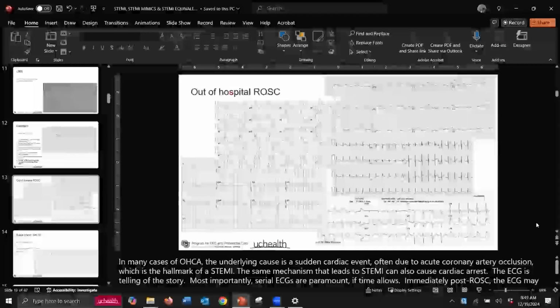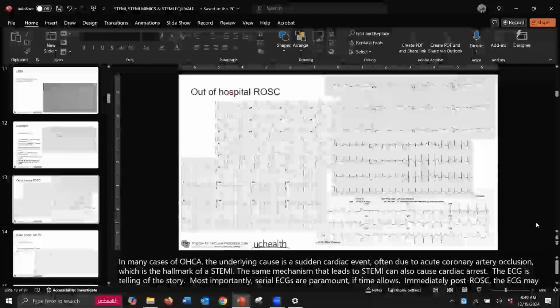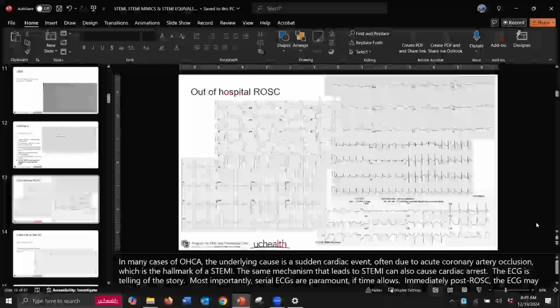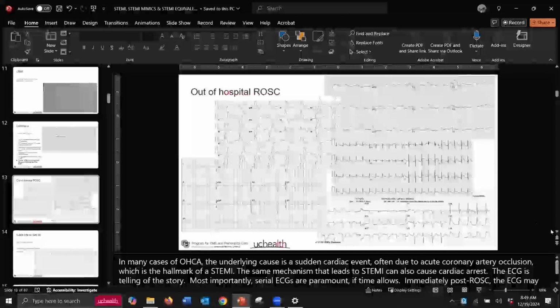Okay. We want to be able to say with some specificity whether this cardiac arrest was caused by a coronary artery occlusion, and do they need acute PCI? I'm in the super rural environment. Guys, I am 2.5 hours away from Denver. I'm 2.5 hours away from PCI. And sometimes in Colorado, things can't fly, right? I want to know whether this patient's going to have to go out to get PCI, or whether we've got a few minutes. Okay, that's the biggest thing.